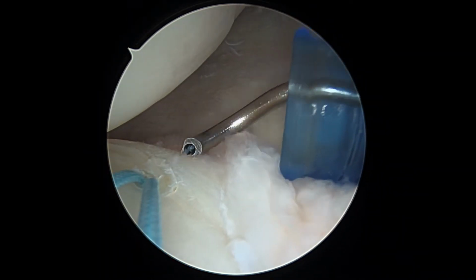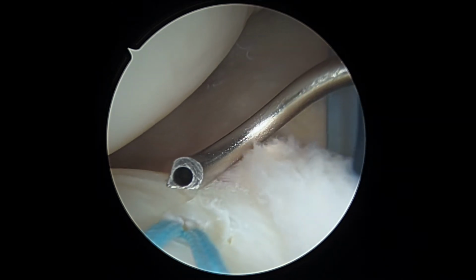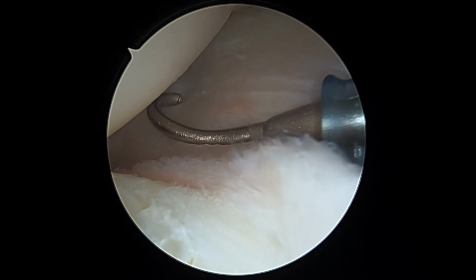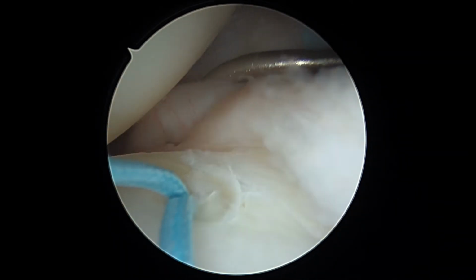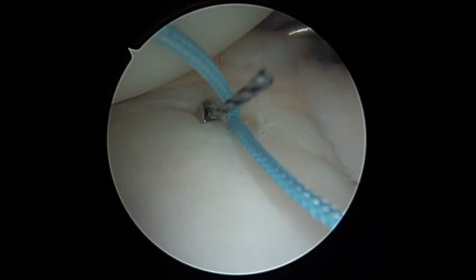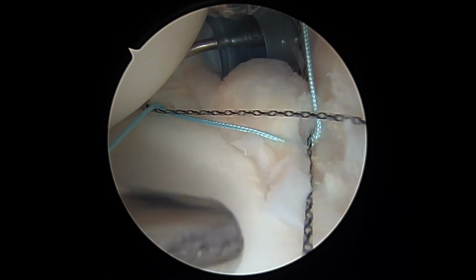Okay, here's our 45-degree turn to the left hook. It's loaded with a black wire that you saw almost a year ago on the other shoulder. And so this is how we're going to end up. So this is how we rehearse the stitch. We'll start here, we'll slowly rotate back. If we want to do a little bit of a shift and tighten a little bit more, we can even push a little bit more inferior. We'll pop through the capsule, just like that. And then we'll come underneath the labrum. And that's the first part of our pinch tuck, what we call our pinch tuck stitch, as taught initially by Dr. Steve Schneider. So hold the camera there. I'm going to reach in here and grab the relay now.